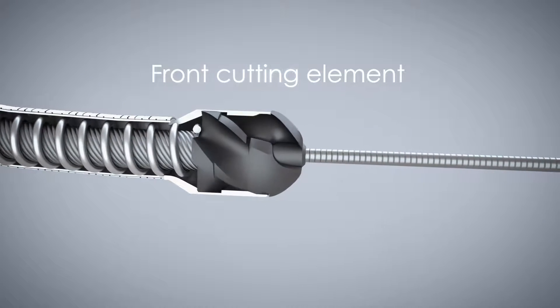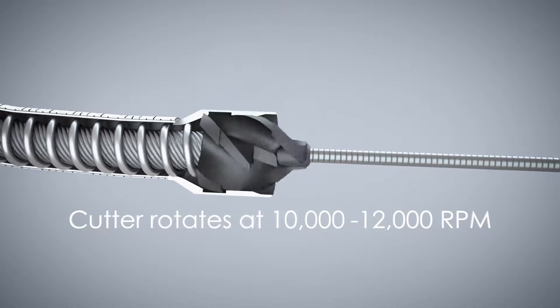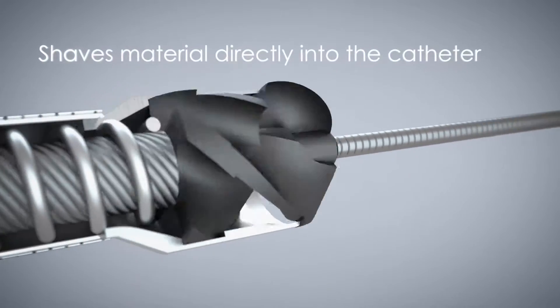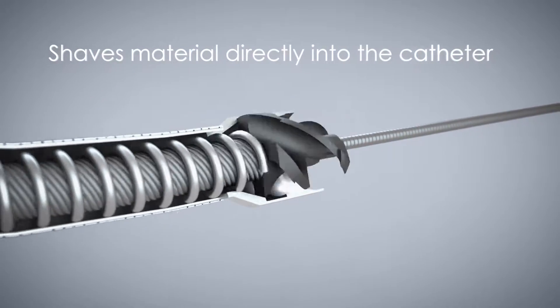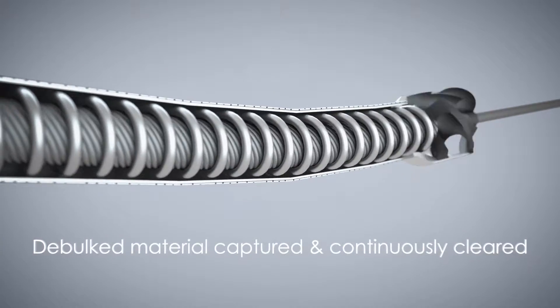It has a front cutting element located at the distal tip which rotates at 10,000 to 12,000 rpm. This cutting element has been uniquely designed so that material is shaved directly into the catheter where it is captured and continuously cleared by an internal Archimedes screw.